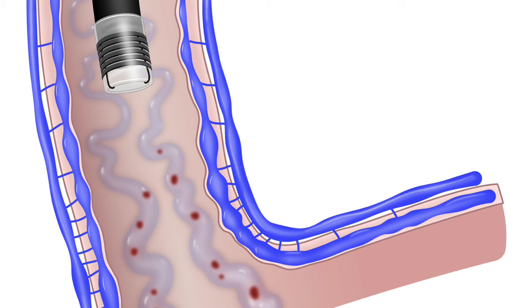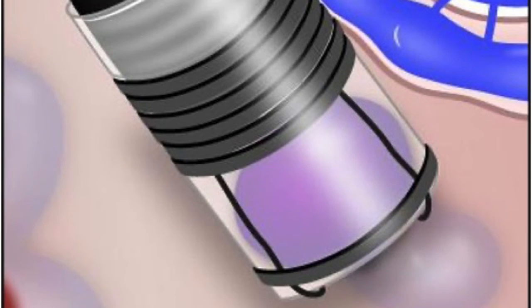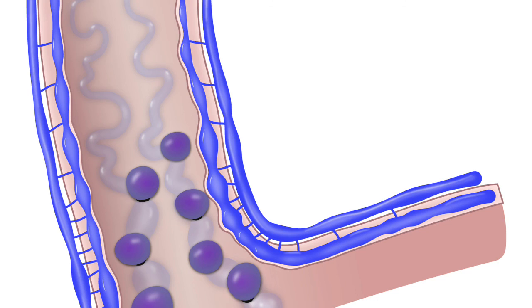So we have the endoscope, we go close to the GE junction, suction, and the band ligator head control is in firing position, and you rotate clockwise till you deploy the band. And then you continue the process and apply up to six bands, and some may even do more, but six bands should be able to serve the purpose.